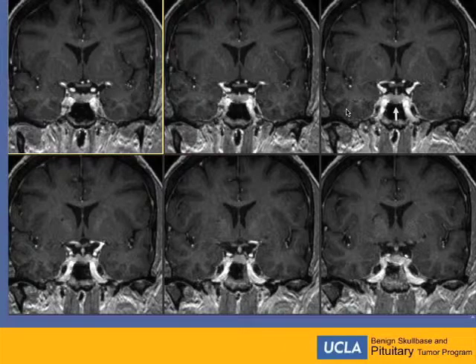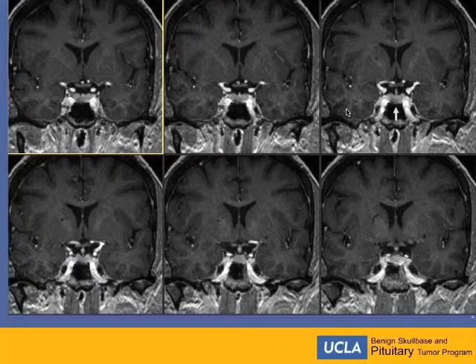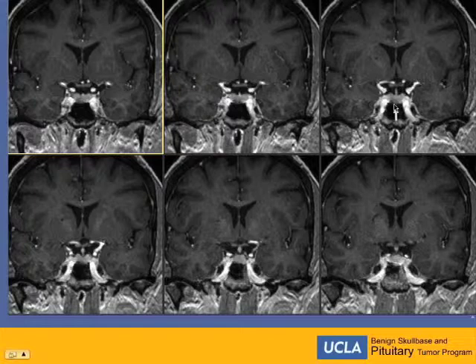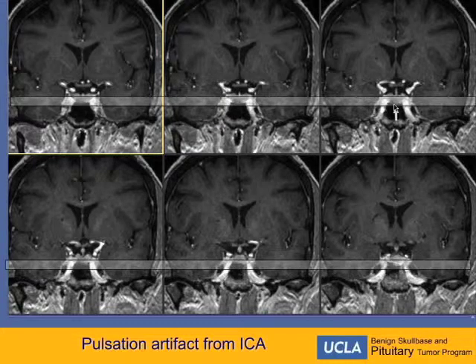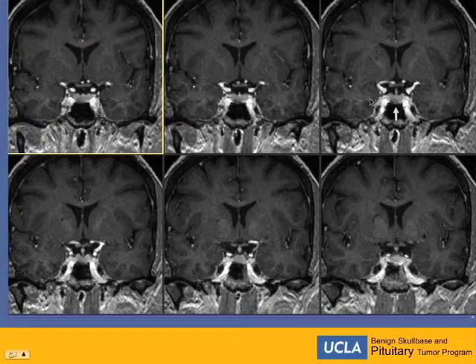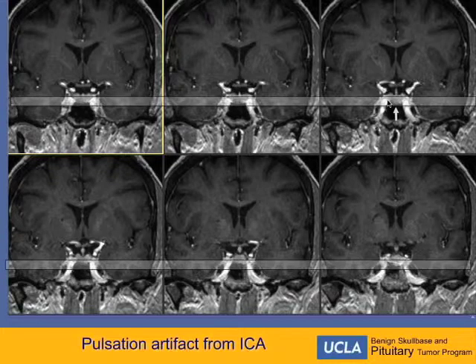One thing we do is use an isometric post-contrast volumetric study — a 0.9 millimeter isometric volume sequence, which allows reconstruction afterward. One thing we have to be careful about: you can see with the white arrow that the inferior central portion of the pituitary gland has a hypo-intense, hypo-enhancing focus, which looks almost like the first case. But if you pay attention, this area has a pulsation artifact from the carotid ICA. You can see a little line going through — this is a very common place for that artifact in the inferior pituitary gland, and it really mimics the sign of a pituitary adenoma.